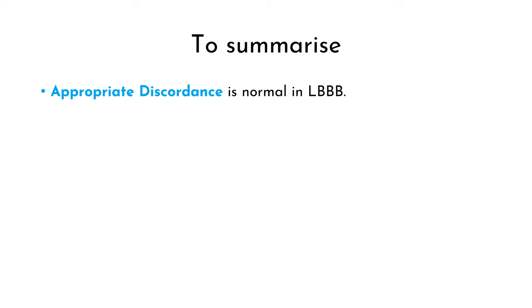And this ECG — does it fulfill Sgarbossa Criteria? There is no concordant ST elevation, neither is there concordant ST depression in V1 to V3. However, there is excessively discordant ST elevation in lead 3 and AVF. In lead 3, it is excessively discordant by around 30%, whereas in AVF, it is excessively discordant by around 37%. There is no other excessive discordance anywhere on the ECG. Since criteria three is fulfilled, the ECG is Sgarbossa positive.